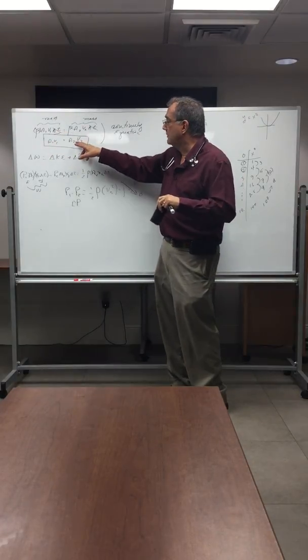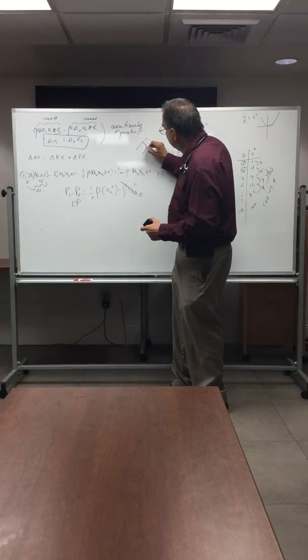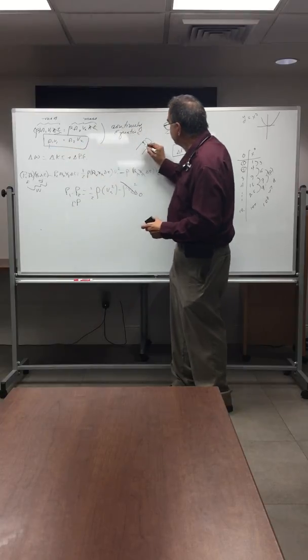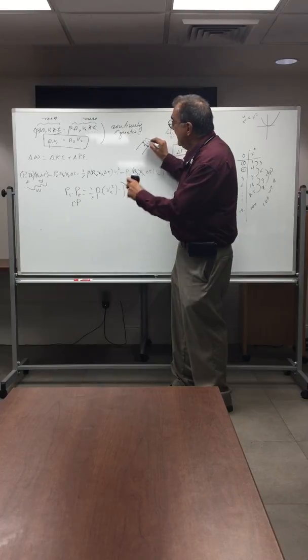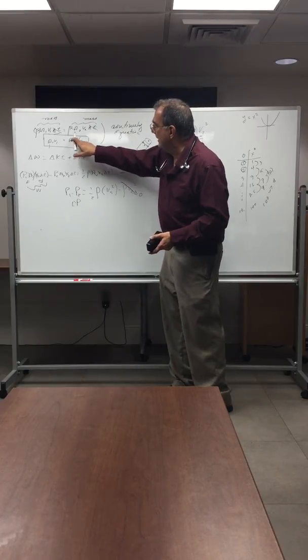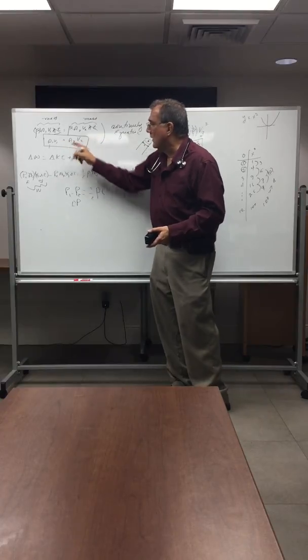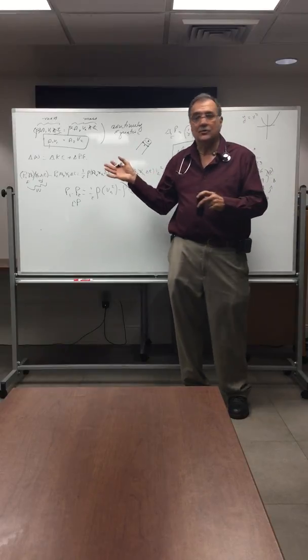And then you have the aortic valve here. You measure this distance, the area here. And then you measure the velocity here, and by a simple algebraic equation, you get the second area, which is the area you want over here, by essentially substituting one over the other. And you get the aortic valve area. And this is what they use in ultrasound.